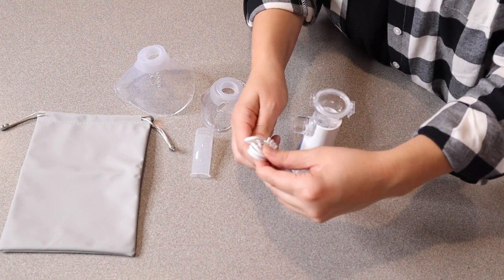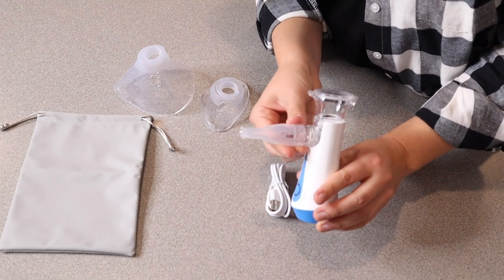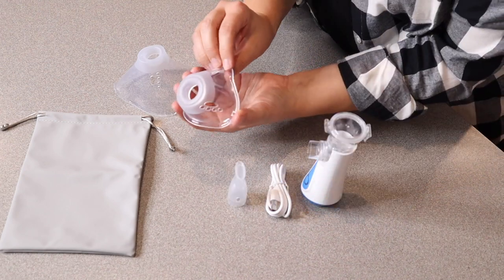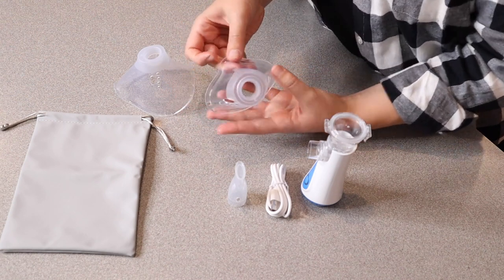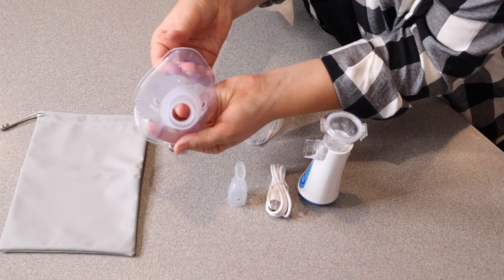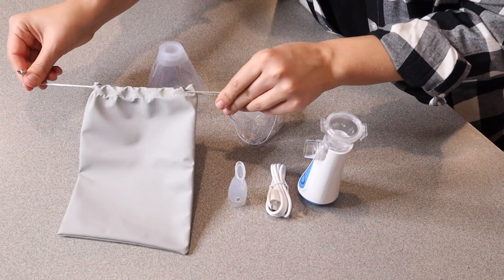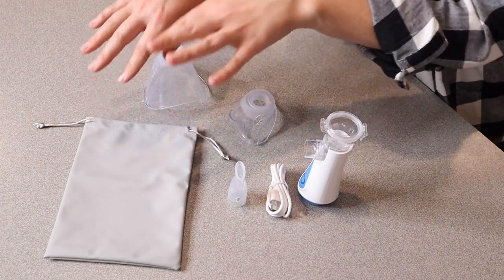We have the charge cable, which is just a type-C to USB charge cable. We have this piece right here if you're just wanting to breathe it directly in your mouth. Then we have this piece that's going to be for a child's nose and mouth to fit in, and that's just going to fit right in the front of the nebulizer itself. And then here is the same thing — it's just an adult size. This also does come with a little drawstring carrying bag so you can keep everything nice and compact in one space for when you need it.